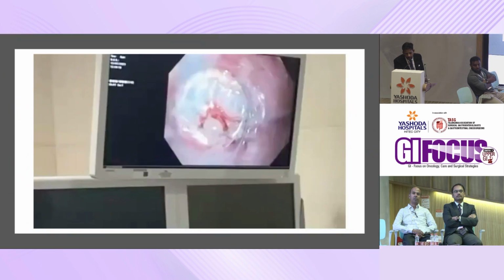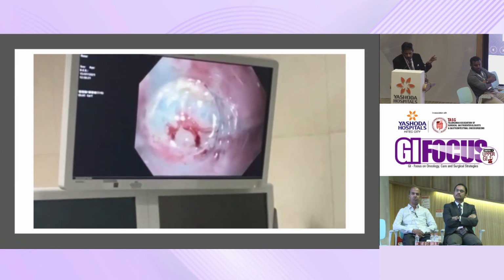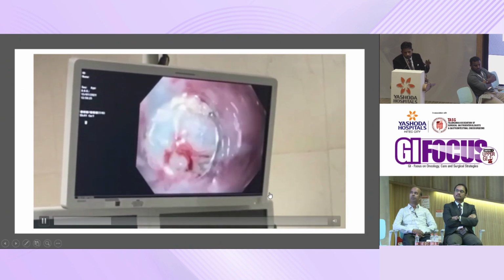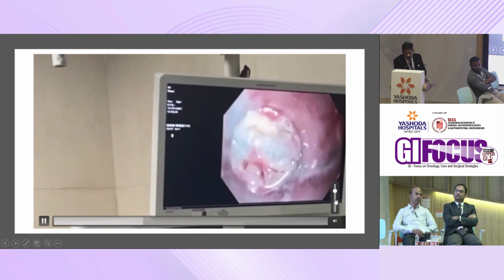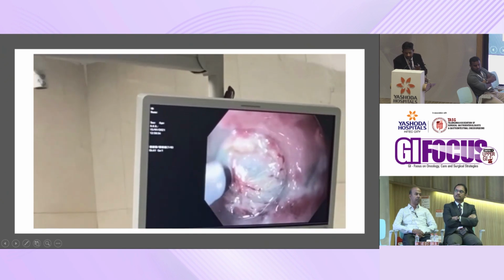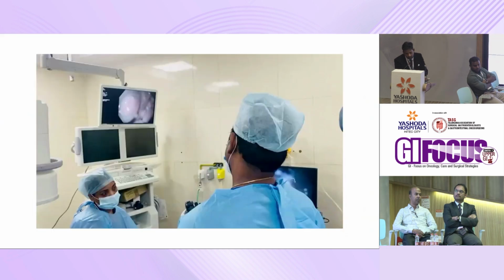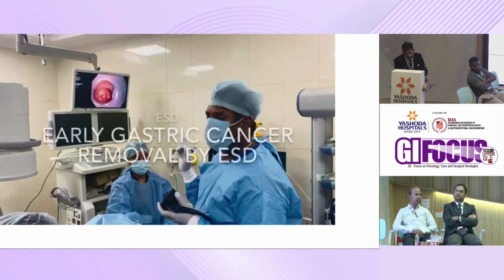And then I'm just showing you here some images about the blood vessel that is there and how you did it, because you see that I bought the conical one from UK to do that. When you're actually navigating through ESD, you need those ones so that you don't cause complications. So that when you got vessels, I also got this Pentax splash knife, not yet released in India, because it has got three-dimensional focus on it. And it just gives you how to select a patient. That's a complete ESD performed on this patient.